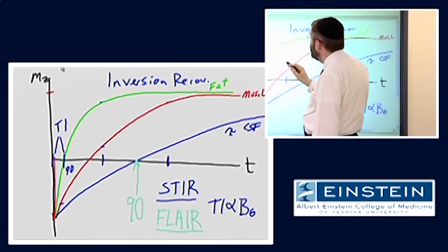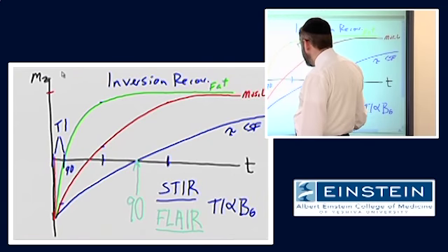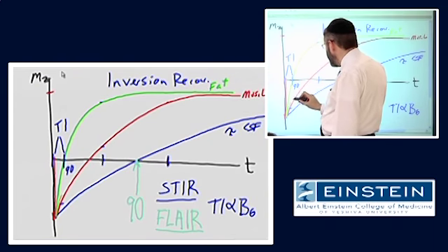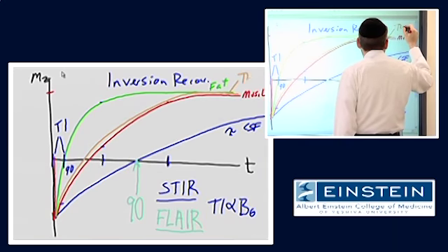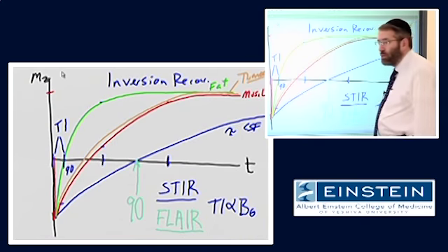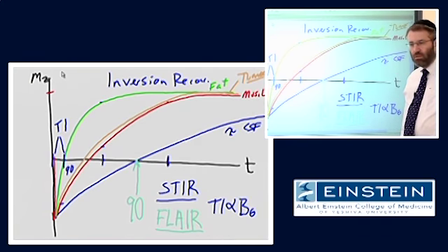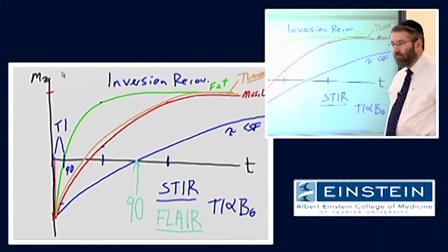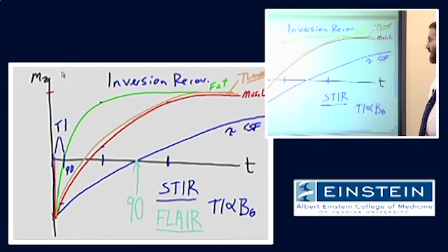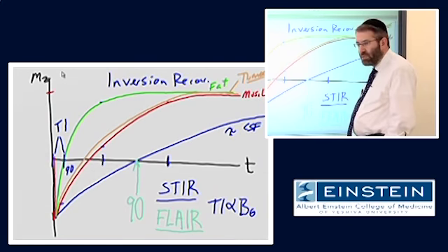But let's say within this lower extremity, or whatever it happens to be, there is also a soft tissue tumor, say a sarcoma, which we already saw on Monday might have very similar T1 and T2, or at least T1, to normal muscle. It might be very hard to detect. And one of the things that we will do to try and bring out the appearance of the tumor is to give a contrast agent.